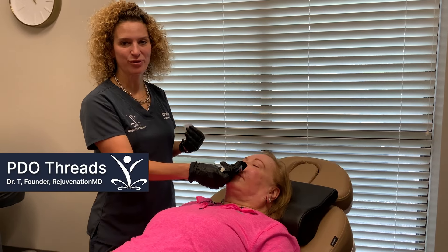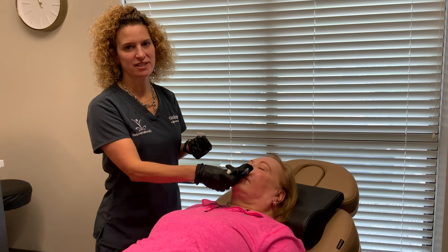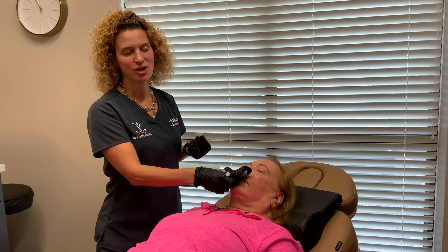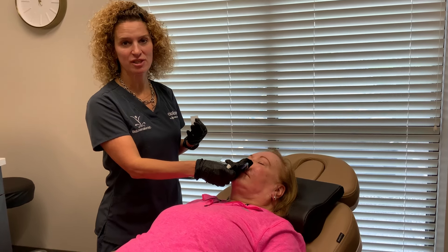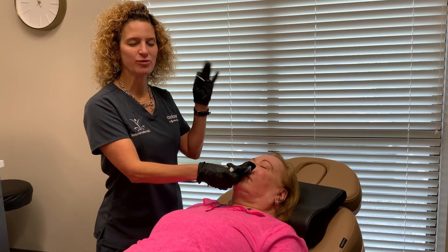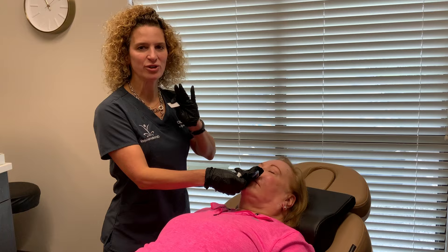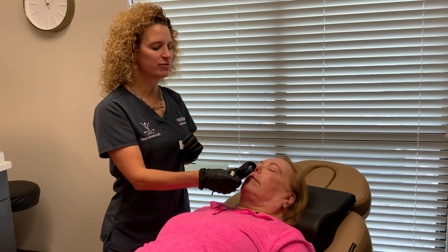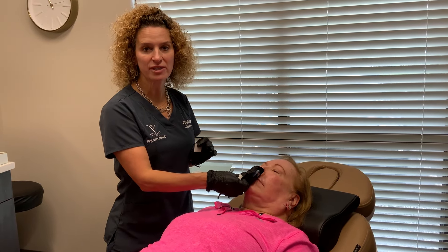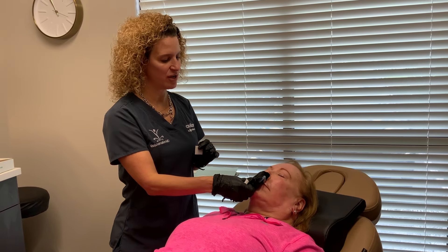Today I'm doing PDO threads to help with upper lip lines. PDO threads stands for polydioxanone, which is the same material surgeons use in the OR — when they tell you don't bother to come back, those sutures are going to dissolve. That's the same material I'm using here. The reason we use it here, or anywhere on the skin, is because it will make you produce collagen. So we are going to make some collagen over our patient's upper lip.